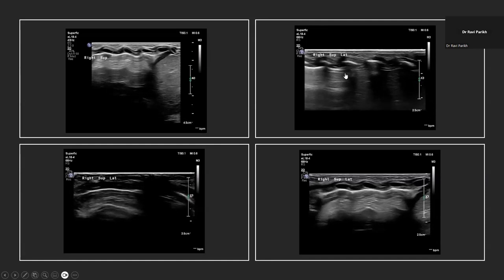What about, this is basically going towards R3. Yeah. So here as well, I don't think that I can see the movement with the baby's breathing, I think, but yeah. Very good. Do you think there is sliding or not? No, no, I don't think there is any lung sliding. Okay, let's get somebody to help you. Anybody else?